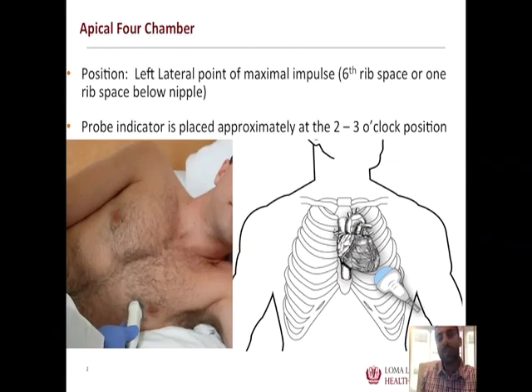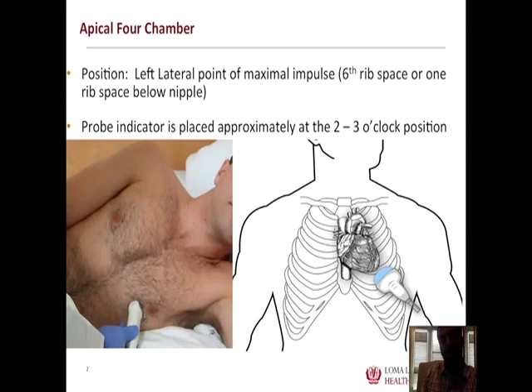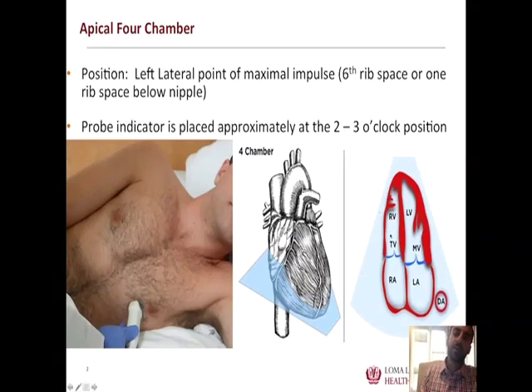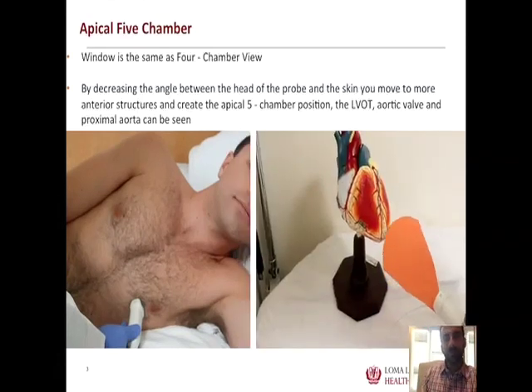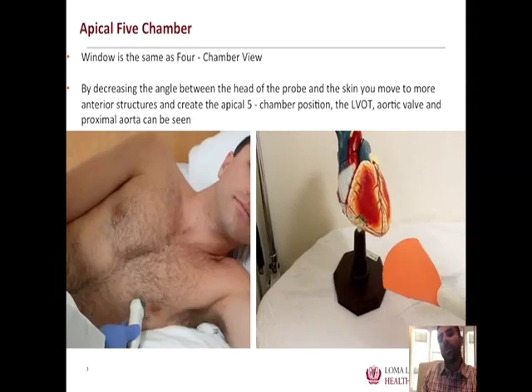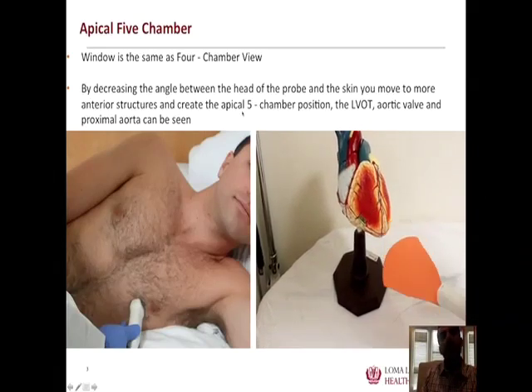For review: we place the ultrasound probe to shine through the apex of the left ventricle, with the indicator at the 2 or 3 o'clock position, ideally around the patient's PMI — ending up around the nipple line, one or two rib spaces below that space. This gives a true long-axis view of all four chambers of the heart — the apical four-chamber view. By lowering the probe angle, you manipulate the probe to see more anterior structures and obtain the five-chamber view, allowing you to insonate the left ventricular outflow tract and aortic valve.